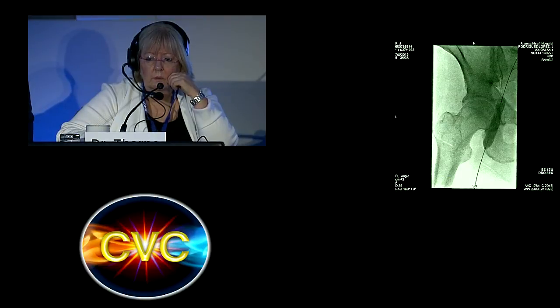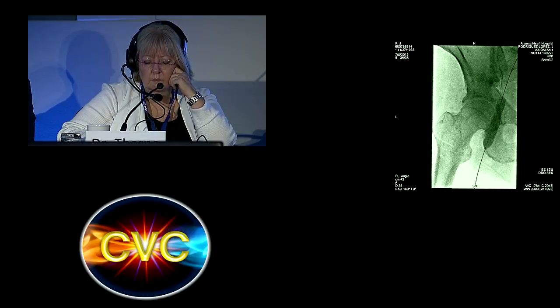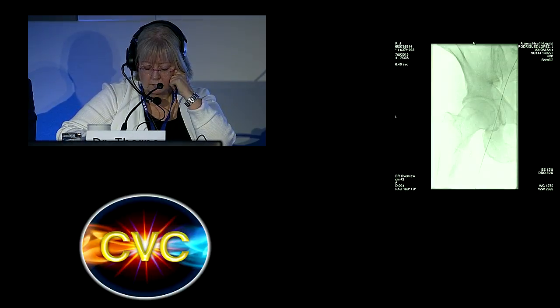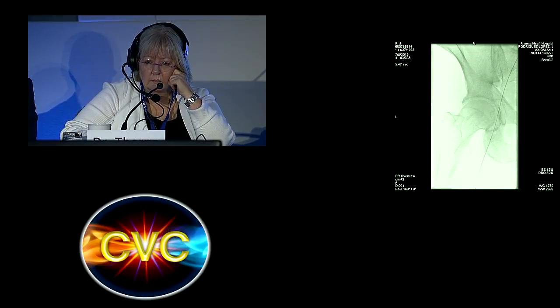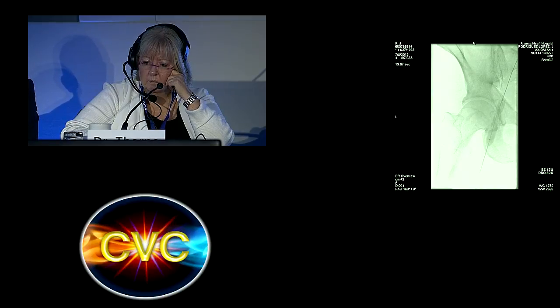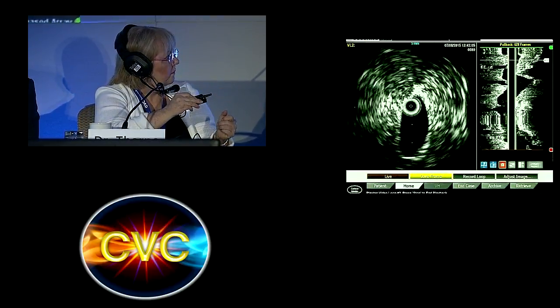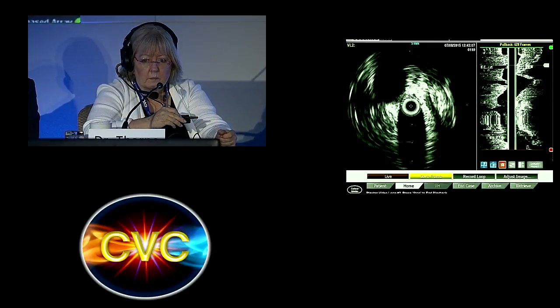Can you do it live, so, I mean, in real time, so we can see the balloon? There was a waist right at that particular area across the femoral head that indicated that the patient really has a stenosis in that area. I measured with the IVUS above and below the stenosis, and it was 11 to 12 millimeters, right there in the middle. I don't know if you can appreciate that. There was a little waist in the balloon. I'm still having something residual right there at the top of the femoral head.